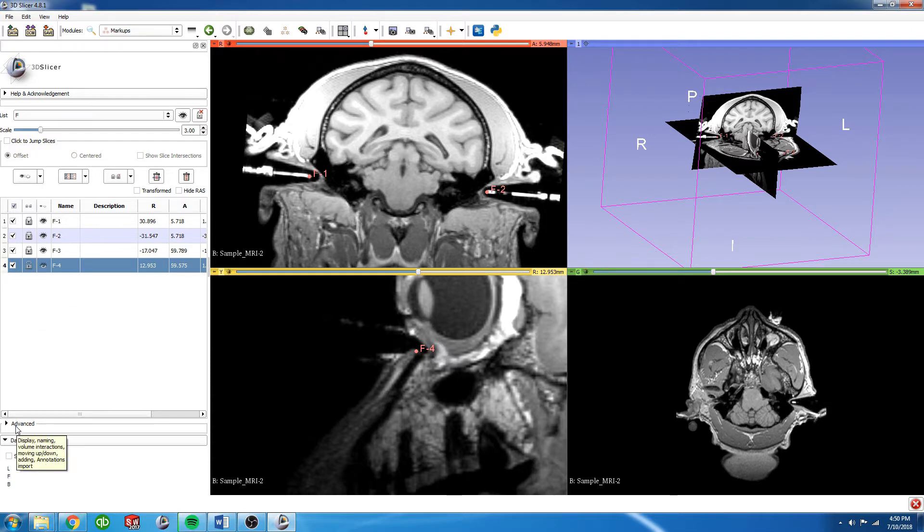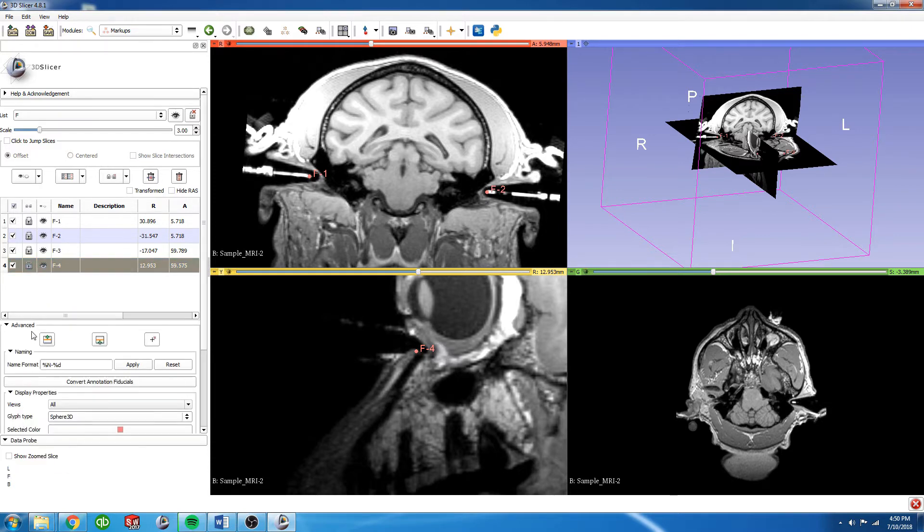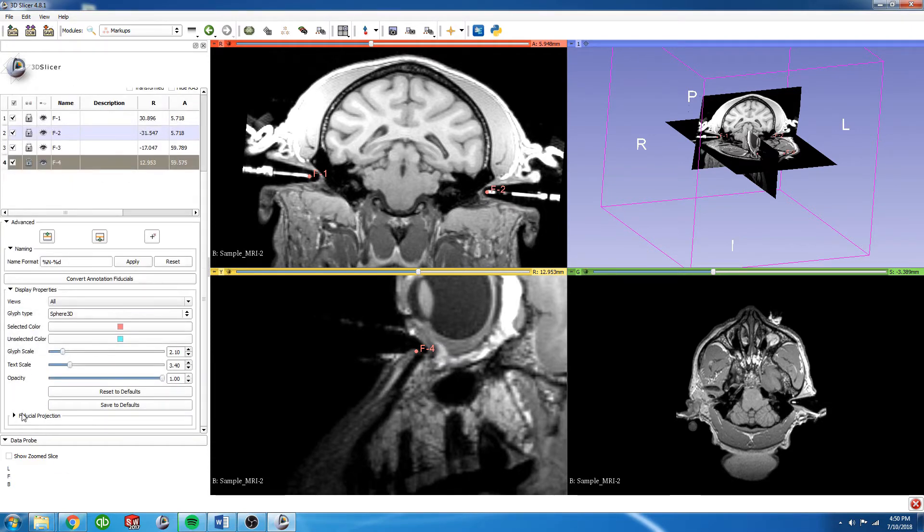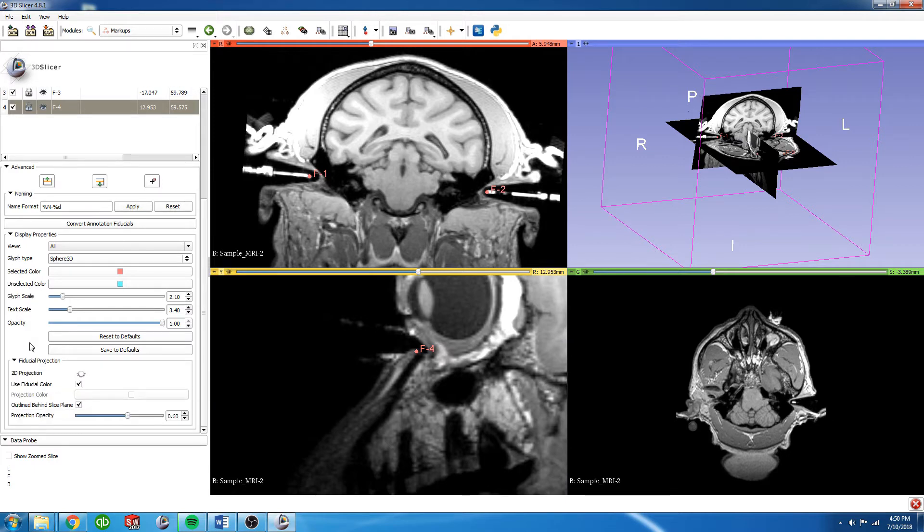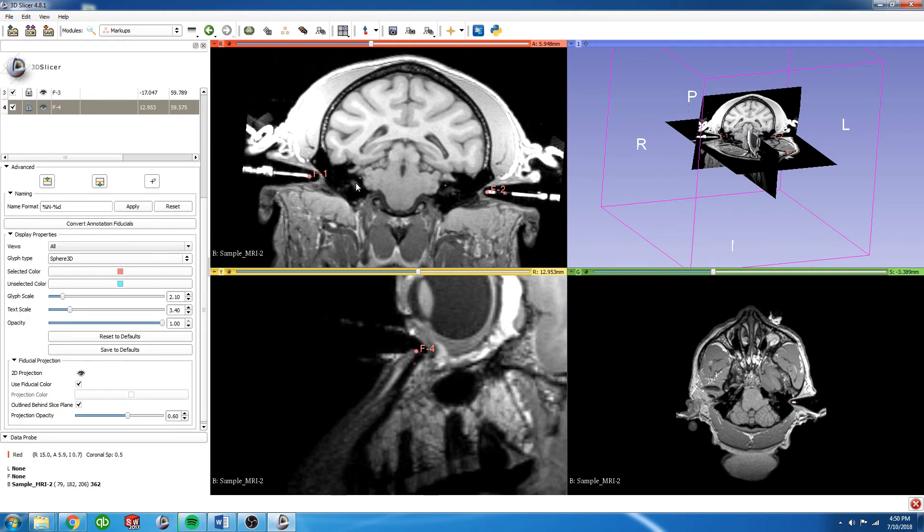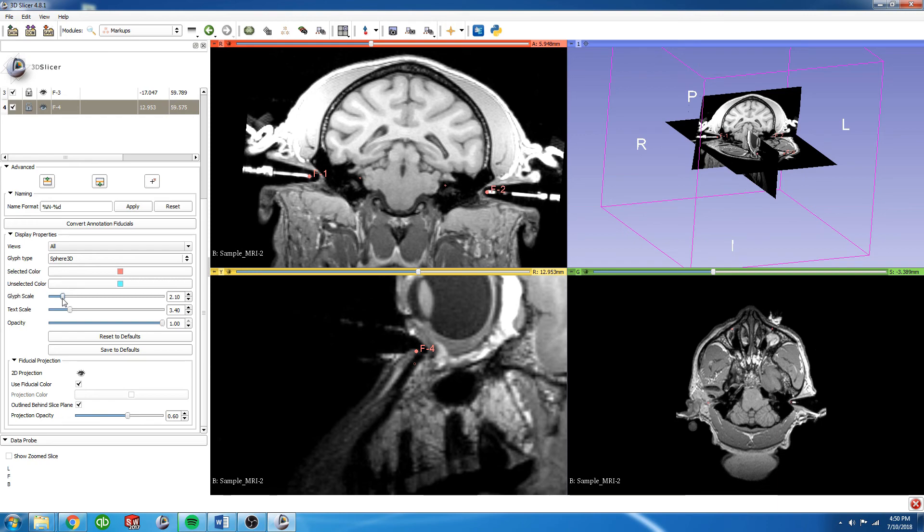We can now go to the advanced dropdown here, scroll down once again to fiducial projection, scroll down, and we're going to turn on the 2D projection eye. This will make it so that all the fiducials are visible through all slices. They're a little bit small there, so you can adjust the glyph scale to make them a little bit bigger.